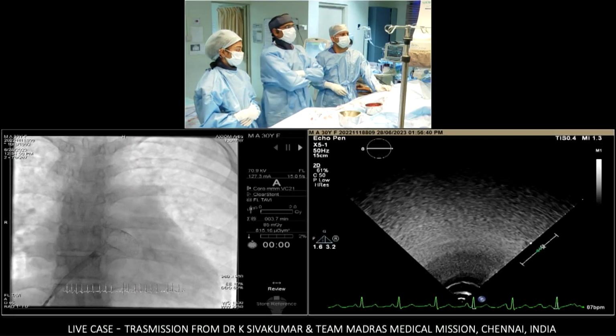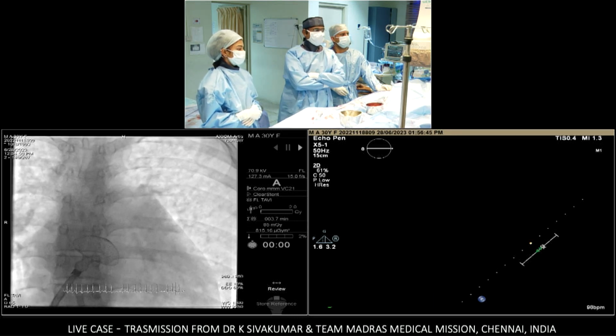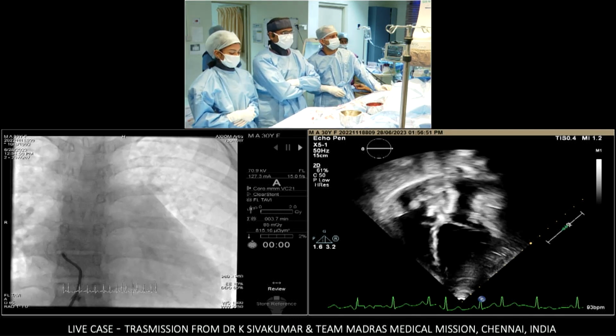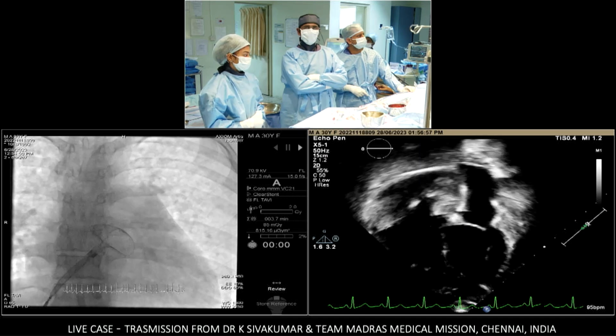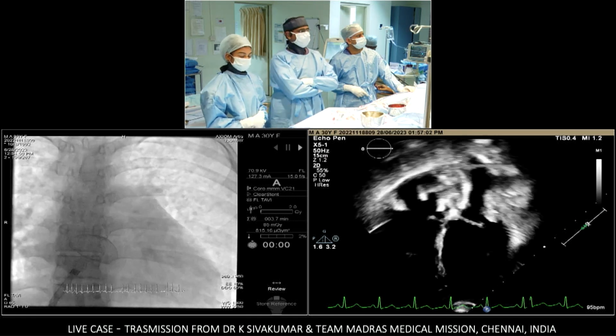Yeah, Bushra, I will tell you the reason why we decided not to put in a transesophageal probe today. The septum was very thin. Yesterday I was doing a 3D transesophageal in the outpatient clinic, and the whole primum septum was so thin that the 3D imaging was extremely suboptimal.